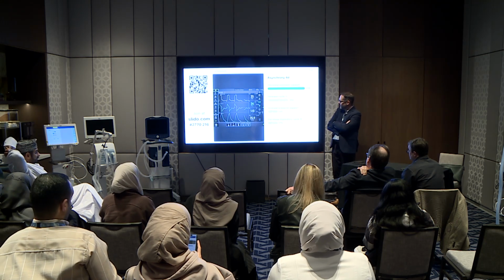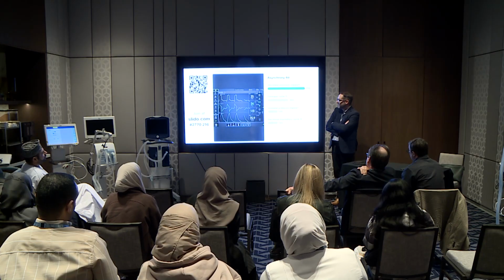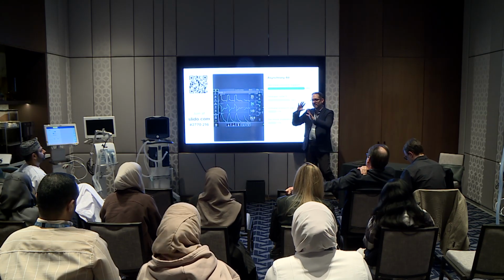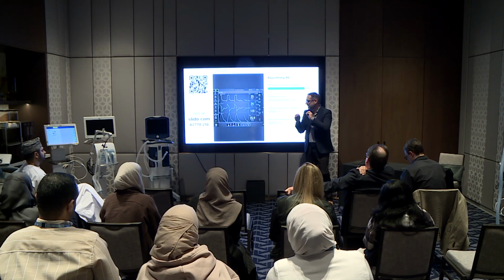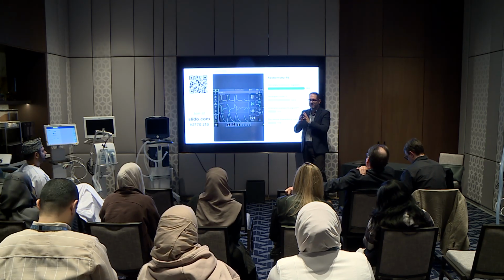Decreased pressure support is the first thing I would do, and increasing the cycle percent is the second thing you could do. Anyone who chose decreased cycle percent is probably just thinking of it incorrectly. Ideally, you want to shorten the breath in this case, because the patient is being over-supported.